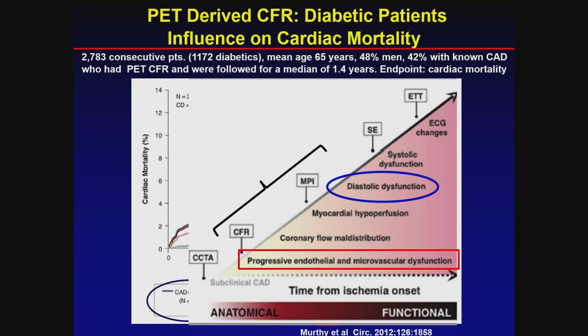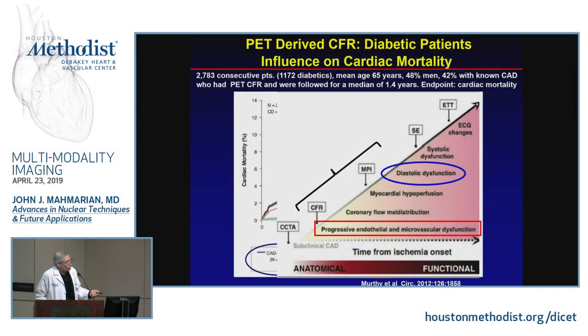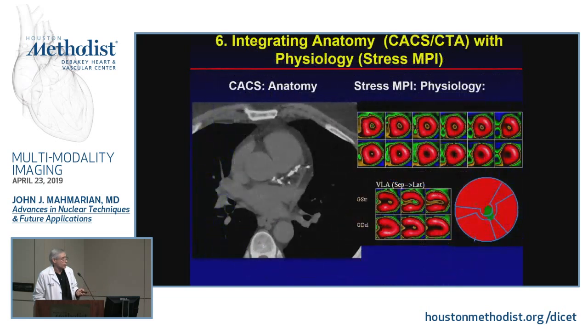And as I said, I think we're just getting into this whole concept of where this all fits together in terms of being able to diagnose people. So this is one of the things I think, once we get our PET program going here, we really need to look at, because the other thing about diastolic dysfunction, and there are data to show this, is that if you take an elderly population that's sedentary who have diastolic dysfunction and they start performing regular routine exercise, their diastolic dysfunction actually improves. It gets better. You have less diastolic dysfunction. Why is that? Is that because they have better recruitment of capillary beds? What's the etiology there? Maybe it has a lot to do with improvement in coronary flow reserve, which could actually be measured by PET imaging. So a lot yet to be learned and identified.